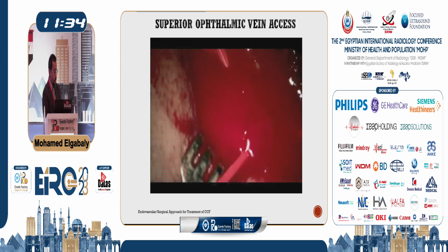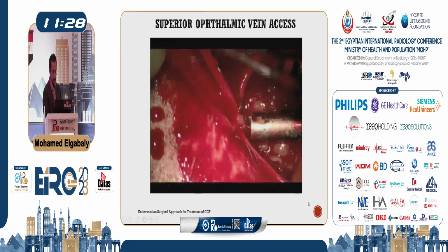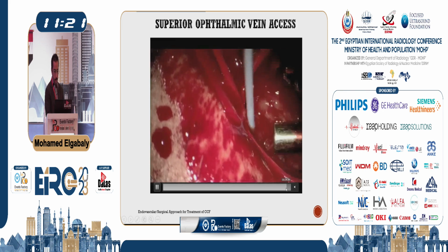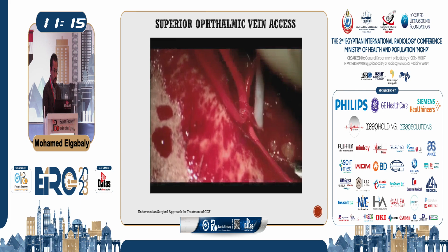So then we asked them to put a wire through and try to put a micropuncture sheath. They eventually had hemostasis. And then this is the sheath going in. I'm trying to be as gentle as they can.